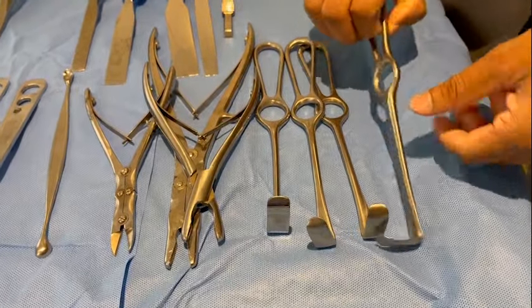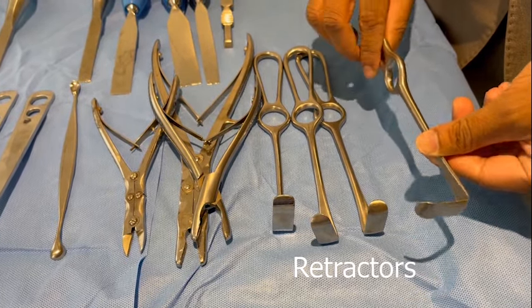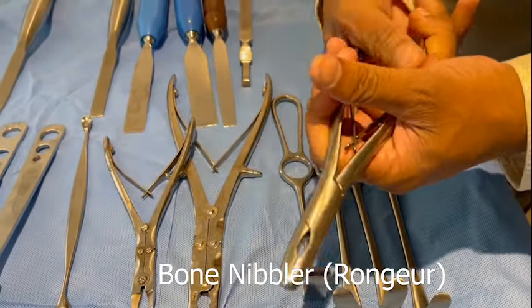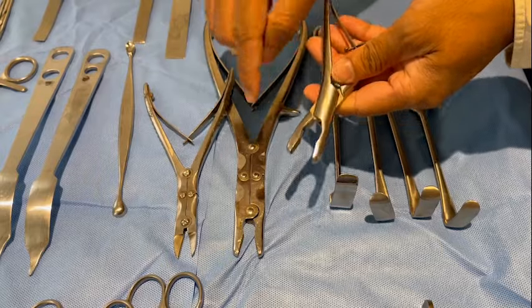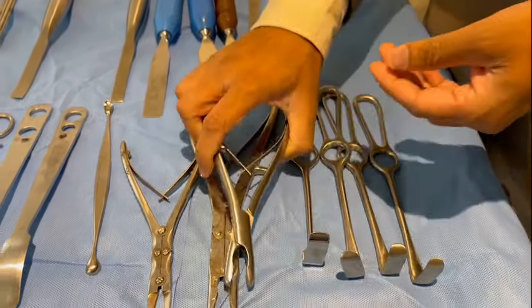Here you have the Langenbeck retractor — options of deep and small, broad and small. This is a bone nibbler — this is a single action and this is a double action bone nibbler. It is used for nibbling away pieces of bone.